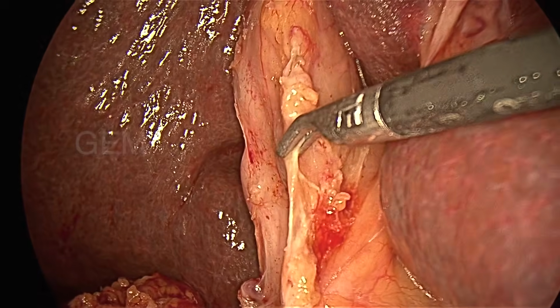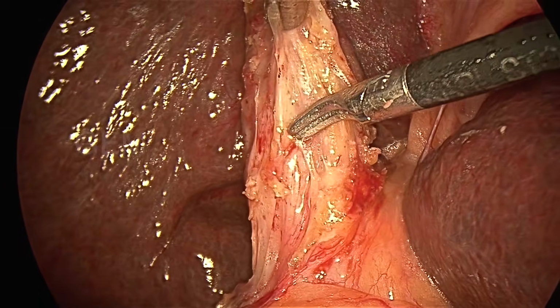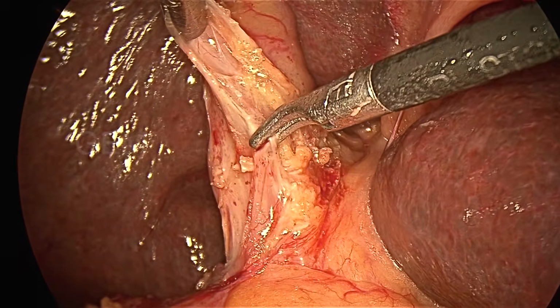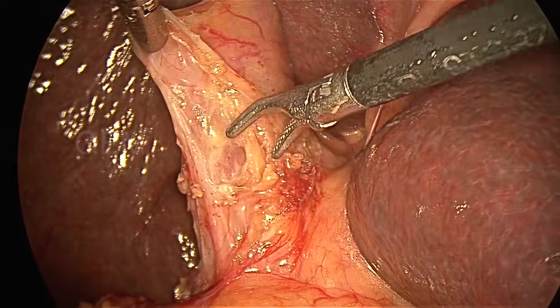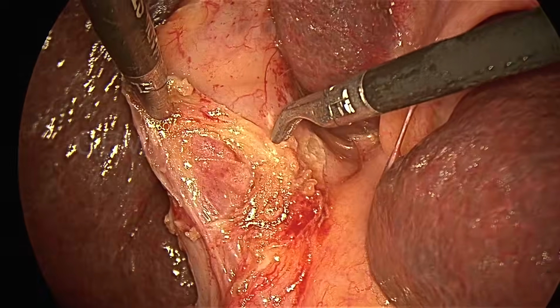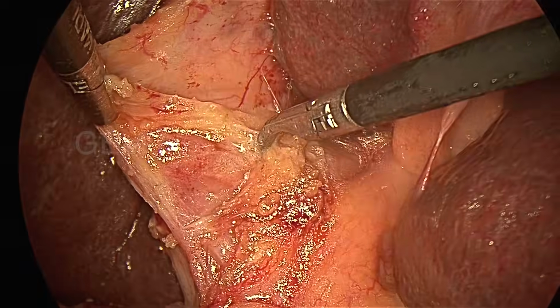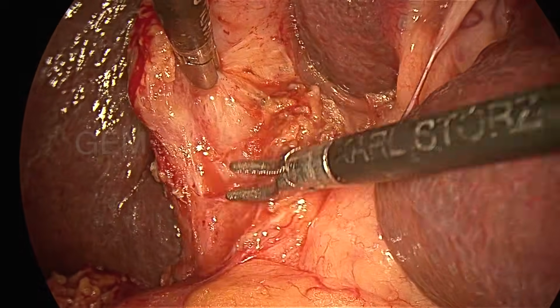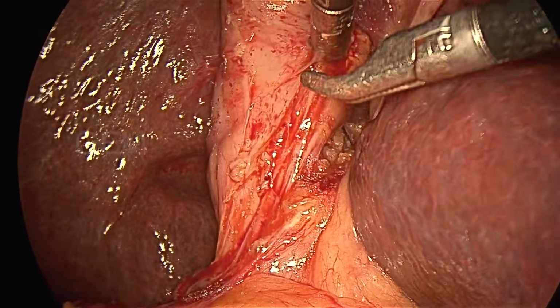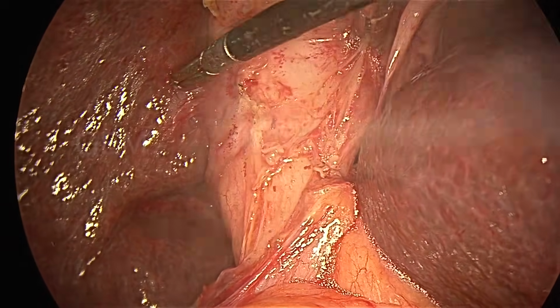It is like an anterior Calot's dissection. I have done it, and always a Maryland with monopolar cautery is ideal. And you can see the chronicity, you are able to feel it when I start dissecting the infundibulum. There is a lot of fluid, that is the fluid in the wall. Now you can see there is no plane between the infundibulum and the right hepatic duct.